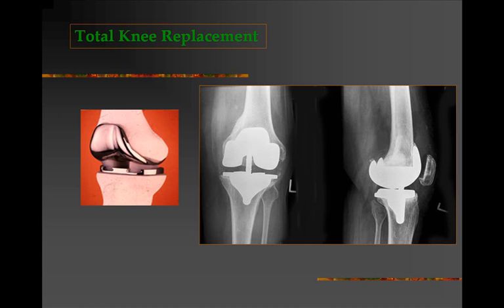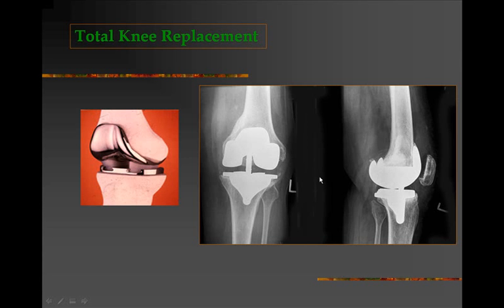Total knee replacement is a surgical procedure done in severely damaged knee joints. The femoral and tibial condyles are cut away and capped using metal prostheses — here is the metal femoral prosthesis and here the metallic tibial prosthesis. Sialastic spacers are placed between these two metal components to take the place of the menisci. X-rays done after the surgical procedure show the metal prosthesis in AP and lateral views.